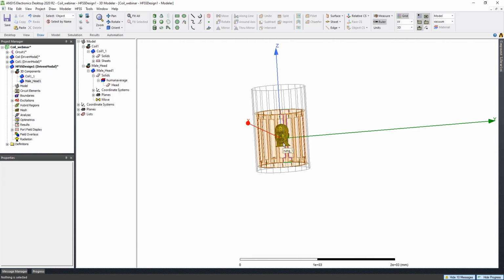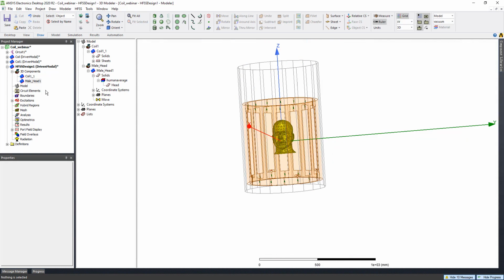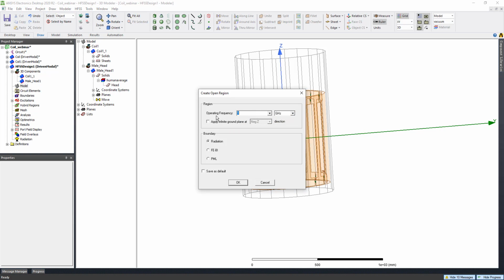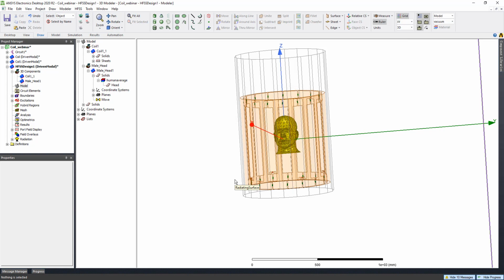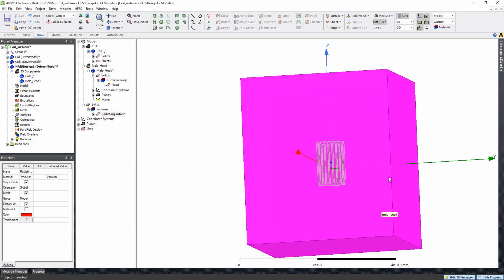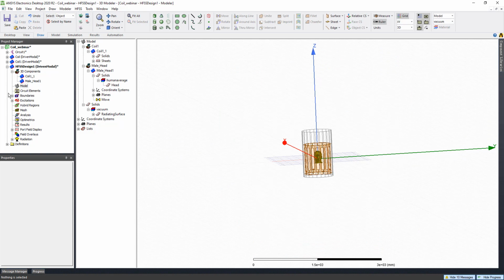I need to have an air box. Sorry, I couldn't come up with the name. Yes, so I need an air box. So I just go to the model, right click, create regions, and simply enter your operating frequency. Then boom, it will create an air box automatically. Where's the air box? Right, it's right here. Okay, so now we have the air box.